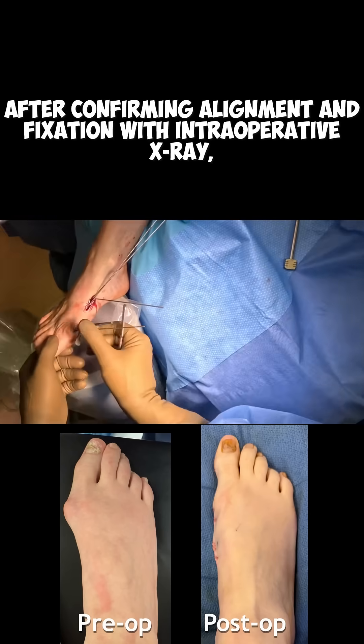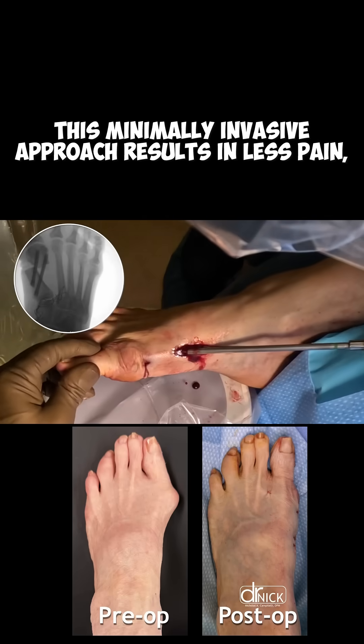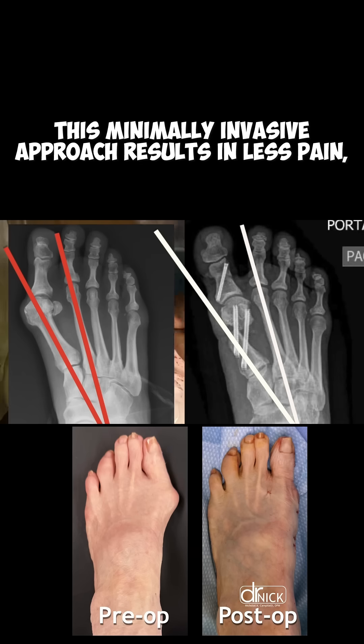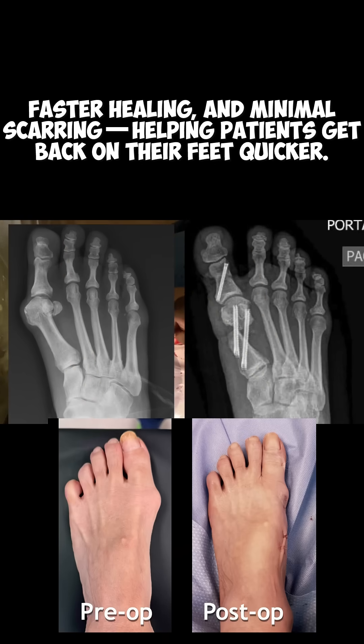After confirming alignment and fixation with intraoperative x-ray, the incisions are closed without stitches. This minimally invasive approach results in less pain, faster healing, and minimal scarring, helping patients get back on their feet quicker.